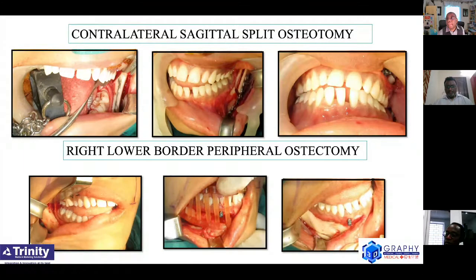And then we did an osteotomy of the mandible on the lower side, on the unaffected side, so that the mandible could be moved. And then came in John's cutting guide, or the drill, or the cutting guide, where you see on the plastic in the screen. And that's my osteotomy marking on the lowermost area of the slide. That's the amount of bone which had to be removed. And this was done with the help of the cutting guide.